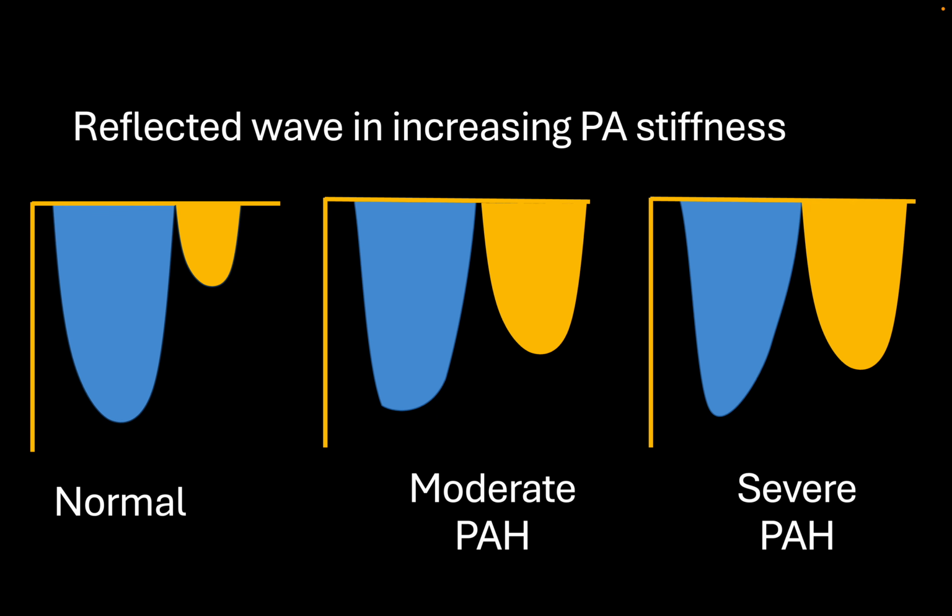Now I'm going to give you the mechanism of how this notching happens, then you would understand. Please go through this video till the end so that I can explain which are the conditions where notching happens, and why, with a hemodynamic explanation.